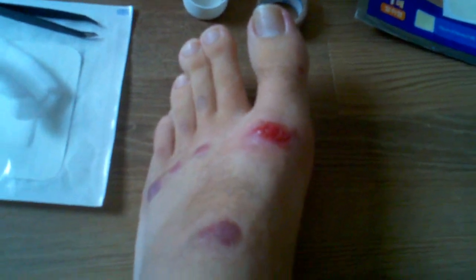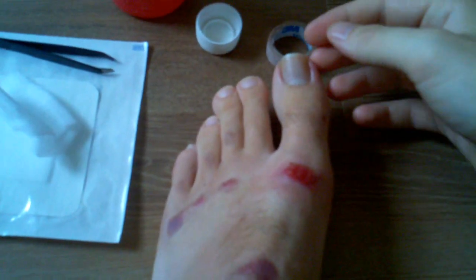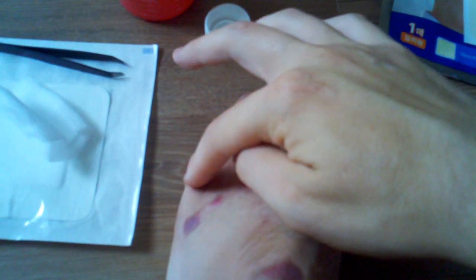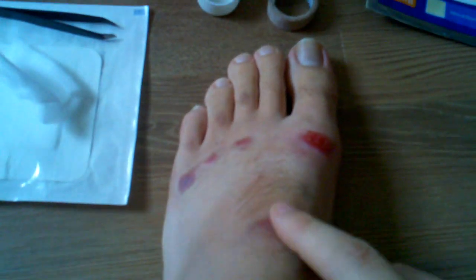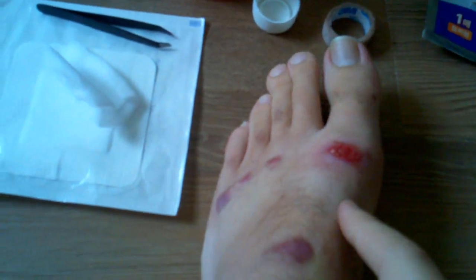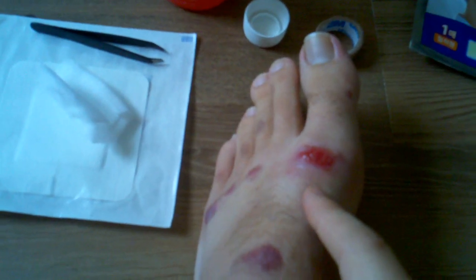But okay, so first you want some standard hydrogen peroxide, and I guess there's a little bit of a background to this video. Let me say that I was hit by a car and my foot took a lot of the impact on the road, and as you can see I had road rash. Maybe you can't see this, but this is cut here. 1, 2, 3 spots on my toes. This guy here is pretty good, and then all along these knuckles here. And of course the worst was this right here. And originally this is a much bigger patch of road rash.